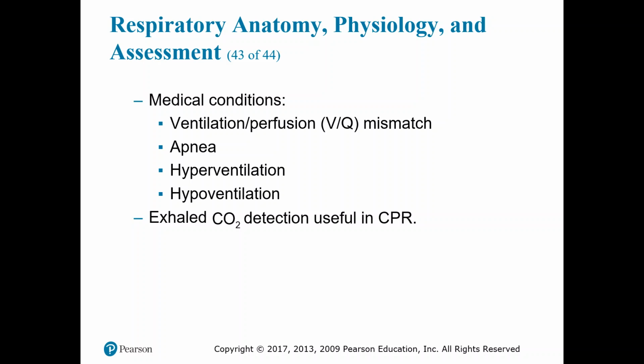During effective CPR, exhaled CO2 levels have been found to correlate well with cardiac output, coronary perfusion pressure, and even with the effectiveness of CPR compressions. Continuous waveform capnography is widely becoming the standard in EMS.